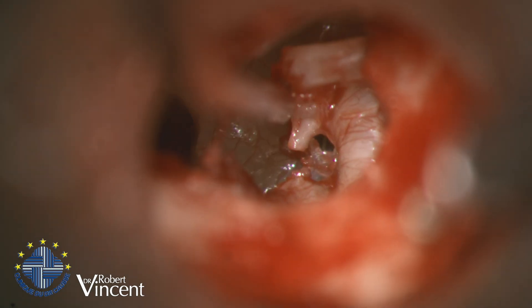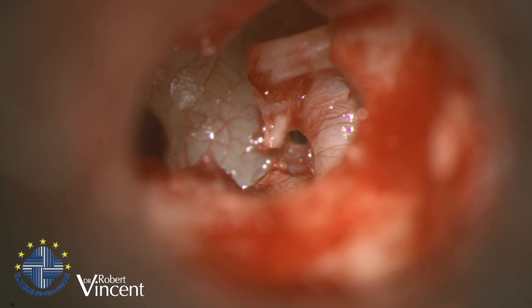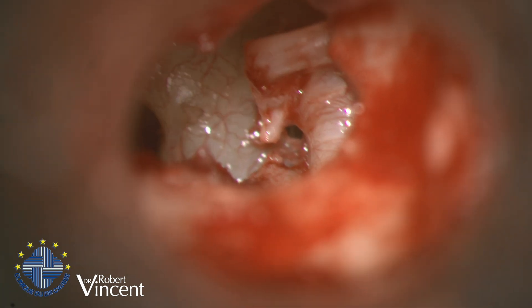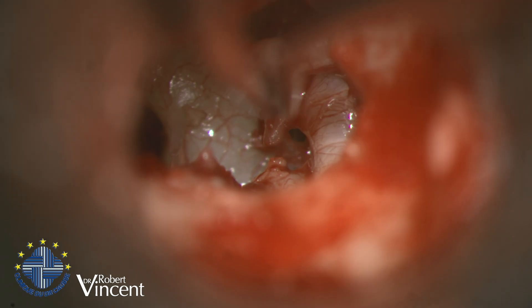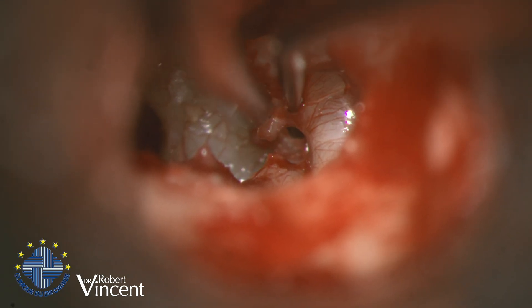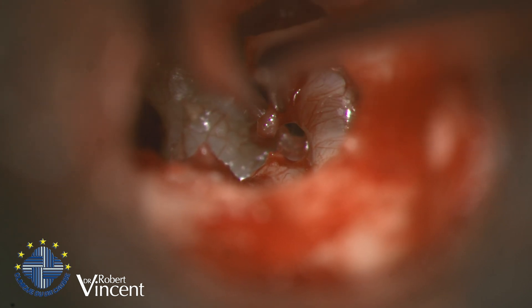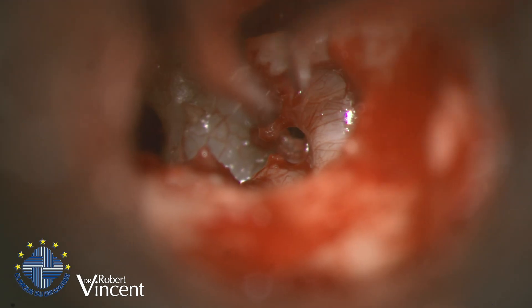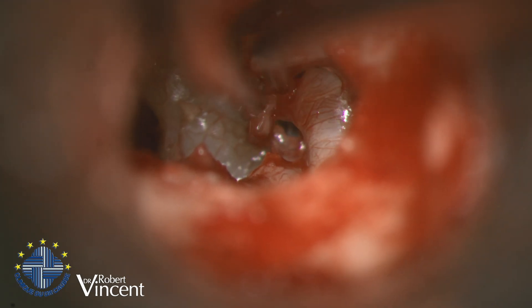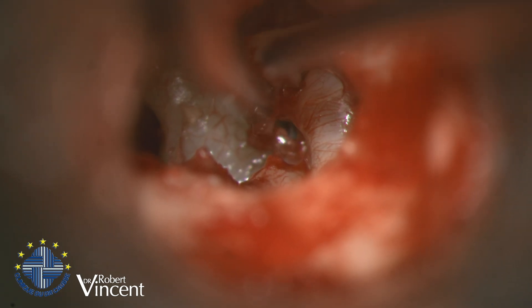The posterior crus has been cut. Now I need to cut the anterior crux, but I need to check the connection between the facial nerve and the stapes. I need to understand how it is connected — if I do it gently it's going to be fine, because I will drive out the anterior crux. The problem is I don't want to overstretch the facial nerve.